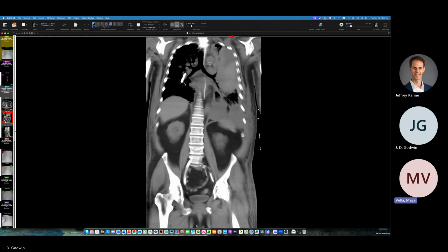I feel like I've asked cardiologists this a couple of times and haven't gotten a clear answer, but does anybody know what happens when the battery dies? Do they just put a new one in? They can remove them. I think they have like a 95 or 90% retrieval rate. You can use the same device to place them, reconnect it, and retract the little tines. But they have like a 9-year battery life or something like that. I don't think they've been around long.